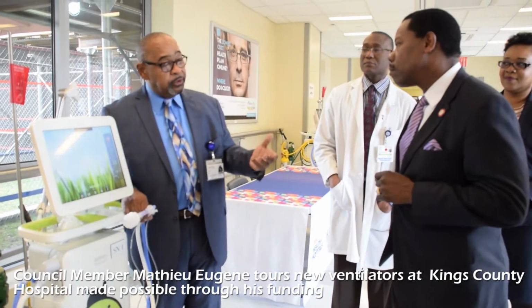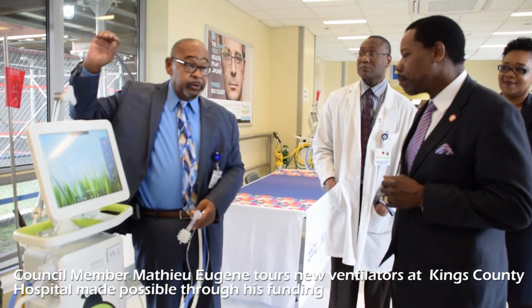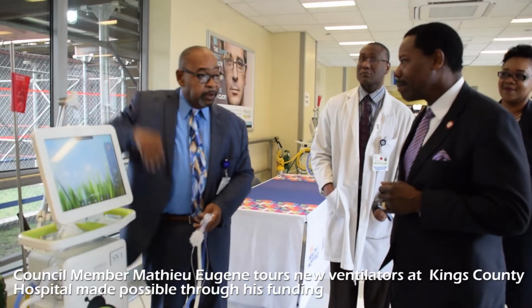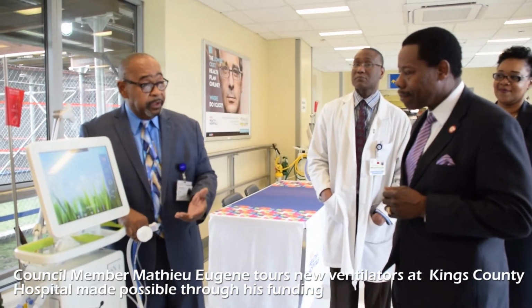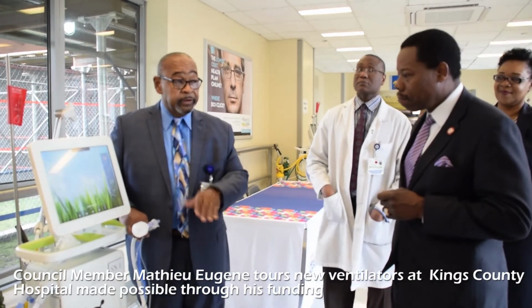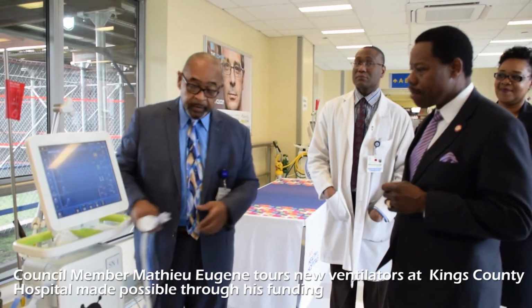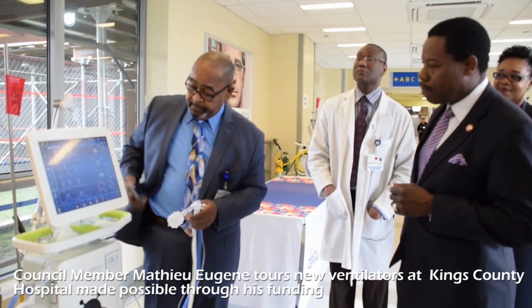Because I'm talking to the nurses in the unit. Now, all those babies in the unit are on a monitor. And that monitor is spitting out all kinds of numbers. And the family's asking, what does this mean? What does that mean? Then they look at the ventilator and they see all the numbers, they see the waveforms, they start asking questions about that. So the whole idea behind this is to minimize their anxiety. And to get out of it, you just touch it. See. Okay. So everything is designed to make life a little bit easier.